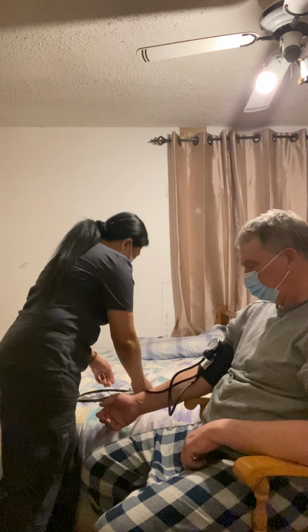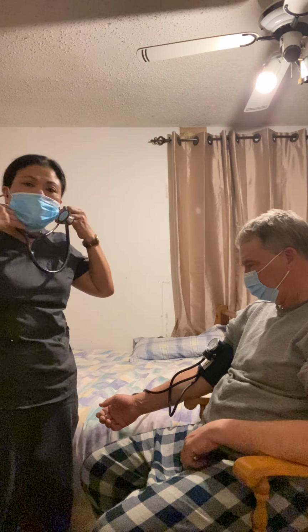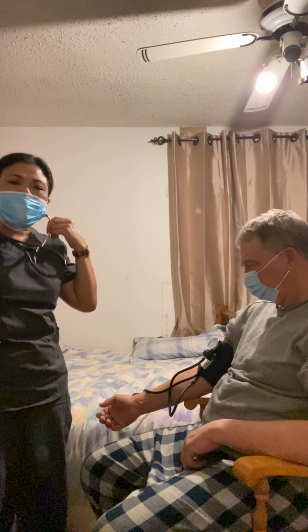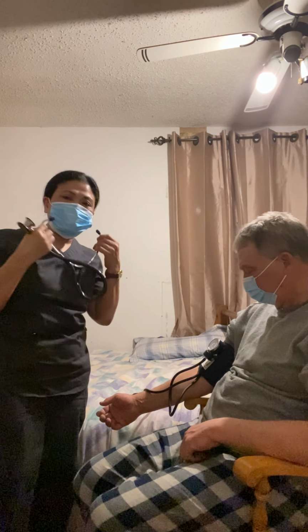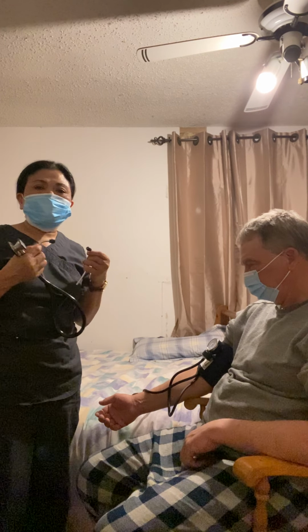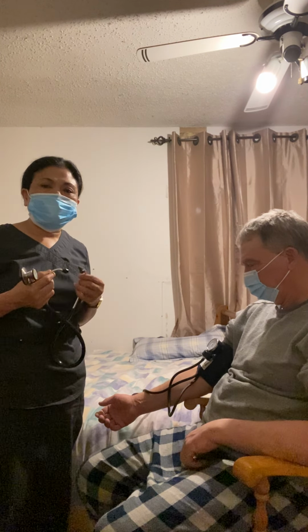Now we're going to use our stethoscope to get the actual blood pressure. We make sure that the first sound that we hear is our systolic number, and the second, which is the last sound, is the diastolic number.